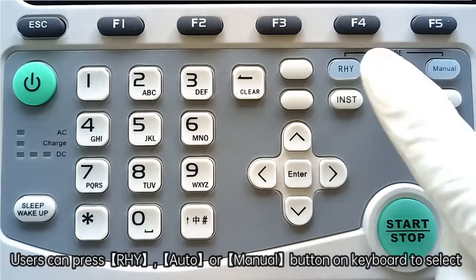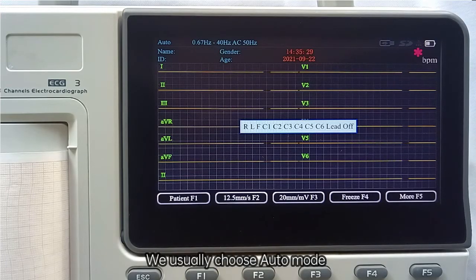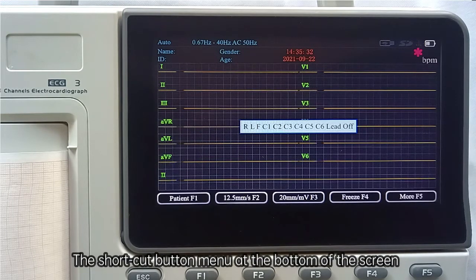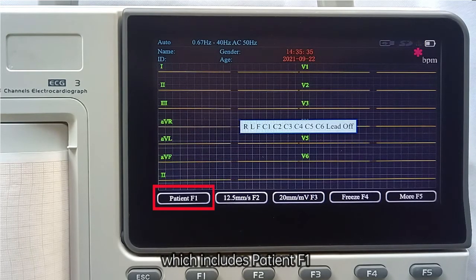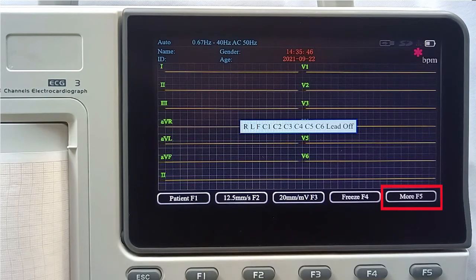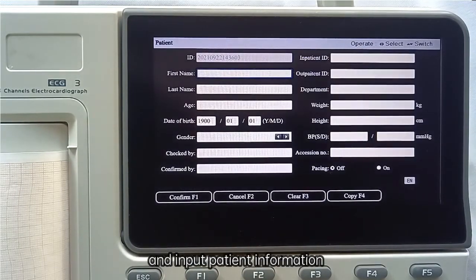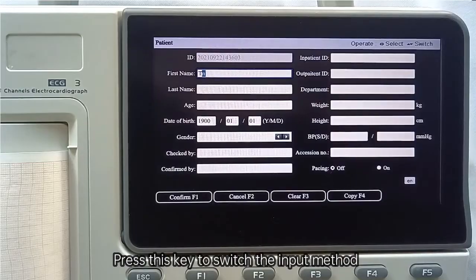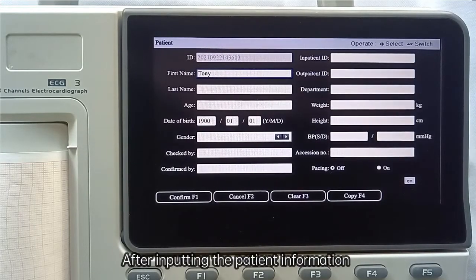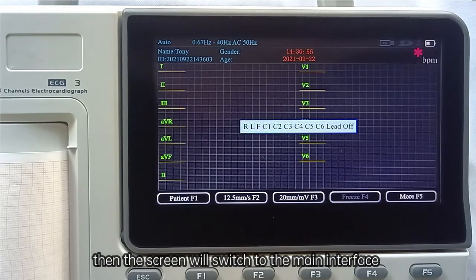The user can press the rhythm, auto, or menu button on the keyboard to select a mode. We usually choose auto mode. The shortcut button menu at the bottom of the screen includes patient (F1), paper speed (F2), sensitivity (F3), freeze (F4), and more (F5). Press function key F1 to open the patient information interface and input patient information. Press the key to switch the input method. After inputting patient information, press F1 to confirm and the screen will return to the main interface.